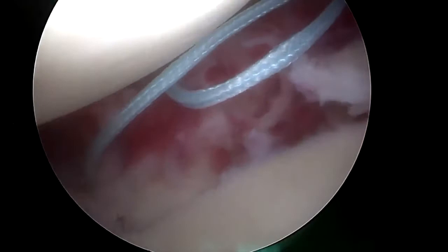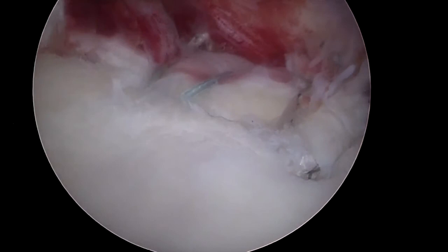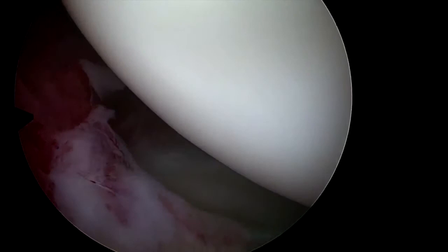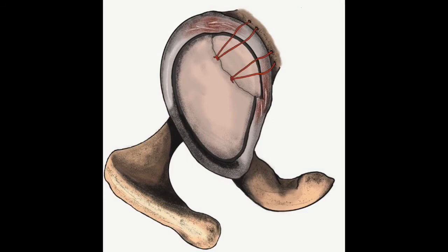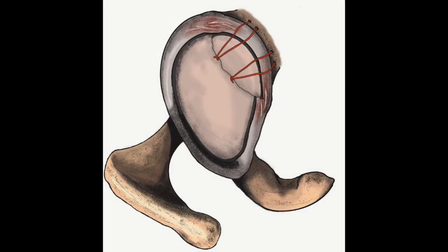Anatomical fragment reduction and adequate interfragment compression are finally verified with a probe. Since fixation is satisfactory, the remaining sutures are removed and the surgery is finished. This drawing is a representation of the final result.